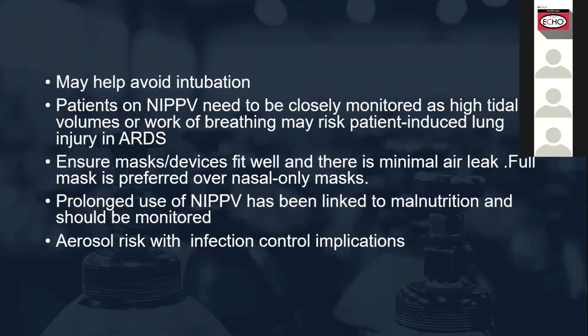With this mode of ventilating your patient, there is a risk of aerosol contamination of the environment, but also of the patients close to the one you are supporting.